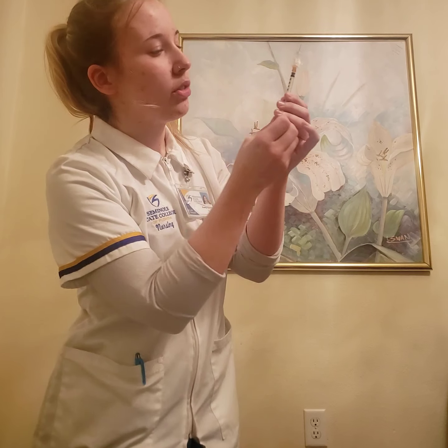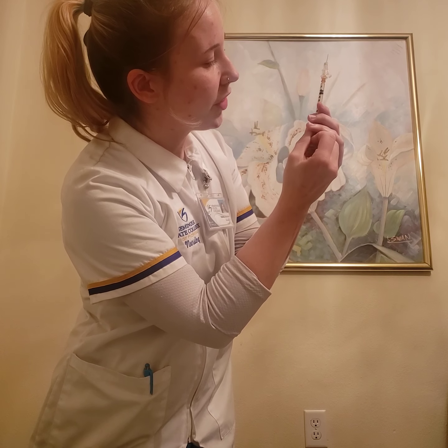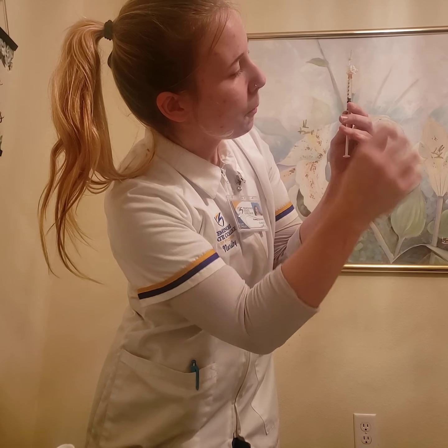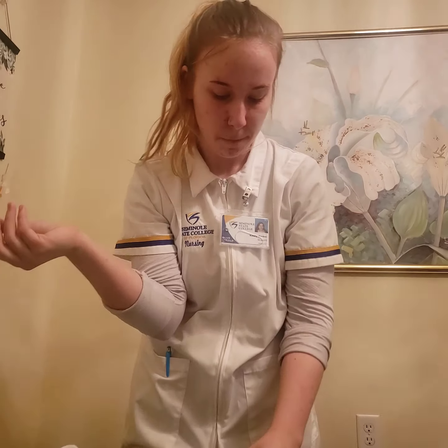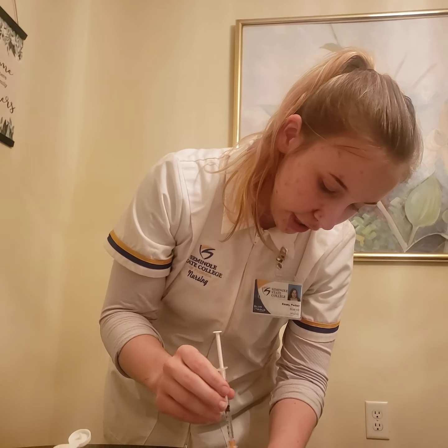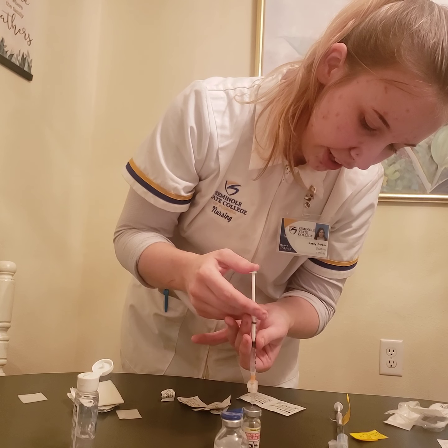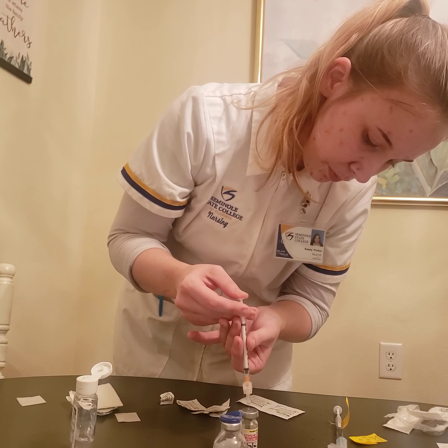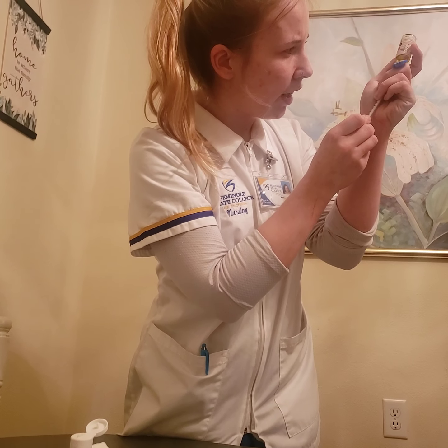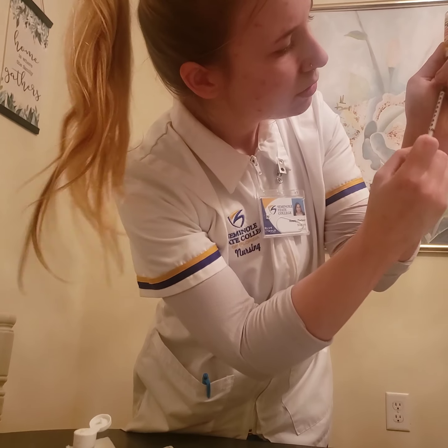I'm going to need to draw back 0.5 milliliters of air into my syringe first. And I also have a label already made up for this one. I'm going to inject the air to air, and then I'm going to invert my vial and make sure to draw back without making any bubbles.